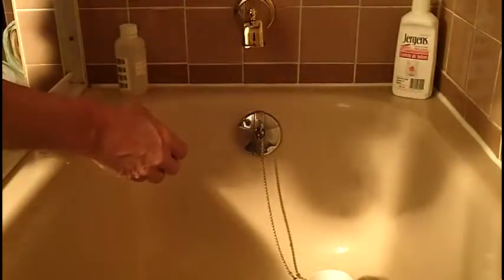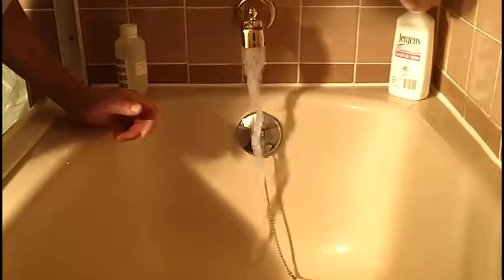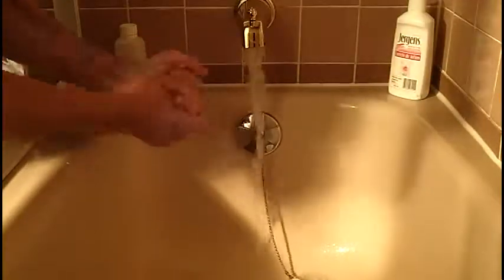Once we've done that, we let the water run — cold water. And while the water is running, we wash our hands to make sure that we remove any bacteria that might be on our hands.